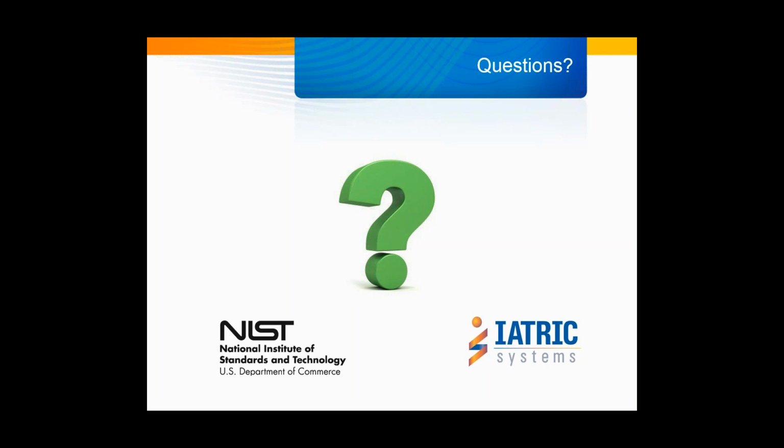Okay, thank you. The next question is, are these IHE PCD standards just for an acute care hospital, or can these be used for home health? Yeah, that's a really good question, because normally folks look at two separate environments. Typically we call them patient care device connectivity and personal health device connectivity. Patient care is typically what we just talked about: the larger devices, your respirators, ventilators, patient monitors, very complicated devices that are often in hospitals or in acute care settings.